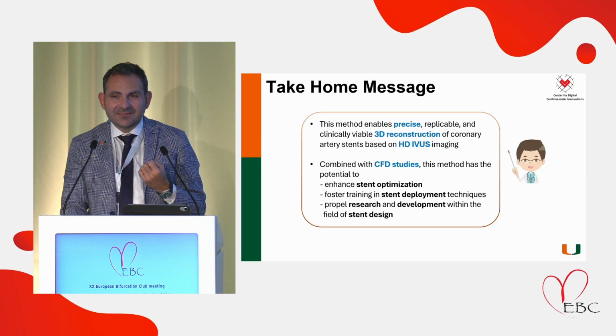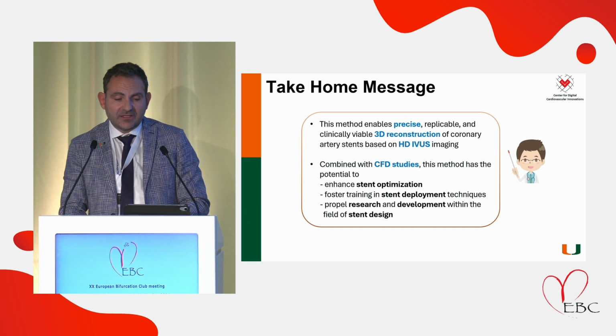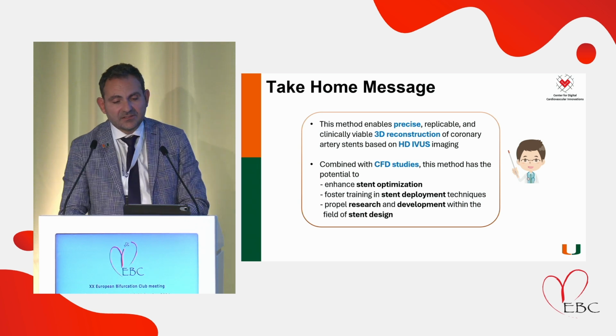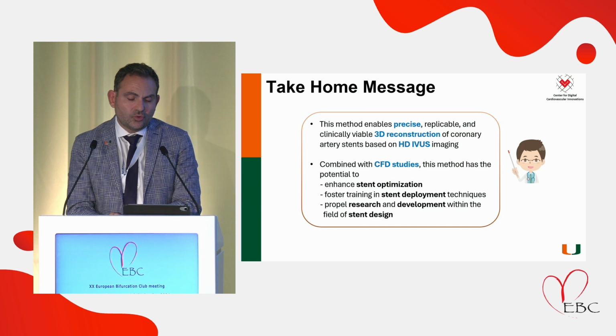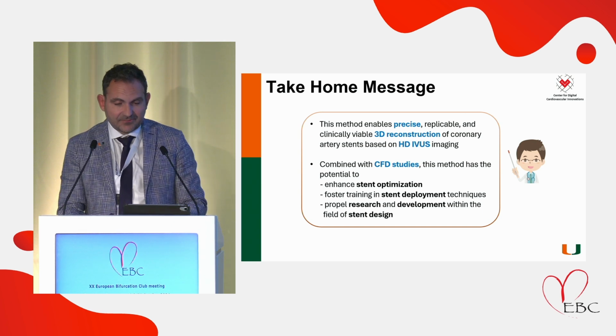improve our understanding. You can use headsets and walk through like a red blood cell with a camera and see how the struts are deployed in your particular patients. And of course, this can propel research and development within the field of stent design. We can essentially use this information, this technique, to advance and refine our stent designs.